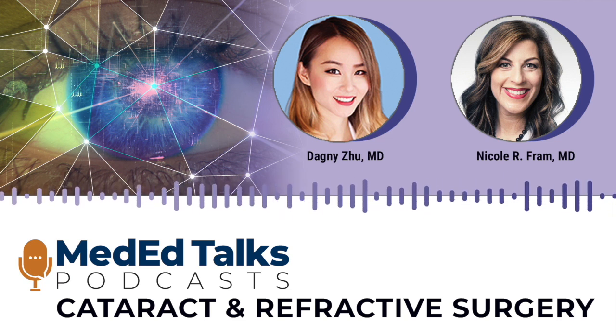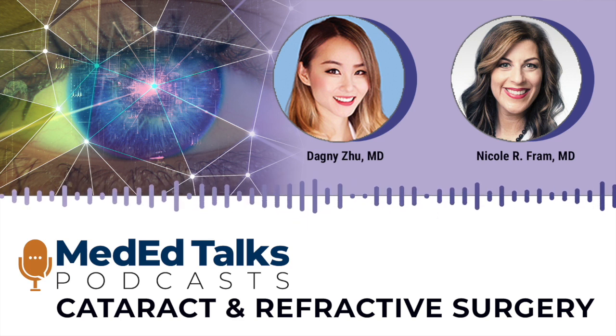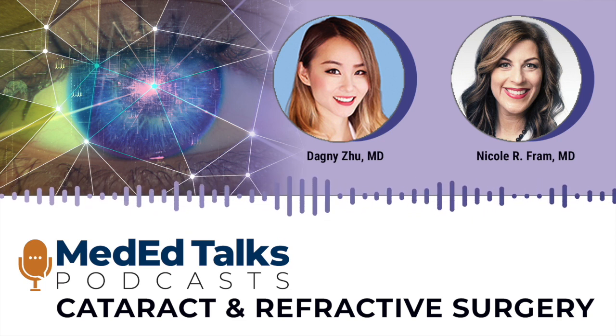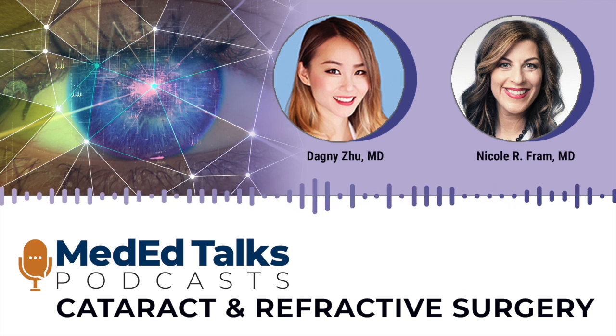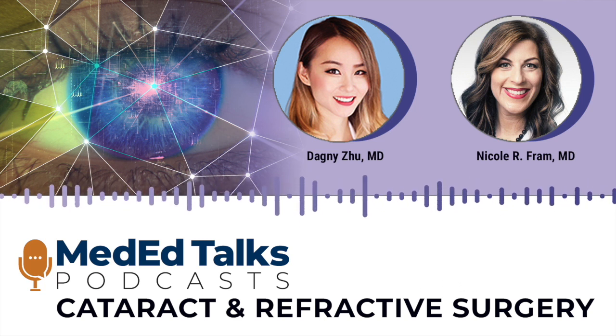This was a tough one for me because I feel like I have every toy I could ever want right now, except for intraoperative OCT. I want that one. But the technology that I'm most looking forward to is adjustability after the surgery, because no matter what we do and how we plan, there are going to be surprises. We have residual astigmatism even when we put it in the right place because sometimes there's IOL tilt. We learned that from the Baylor group.